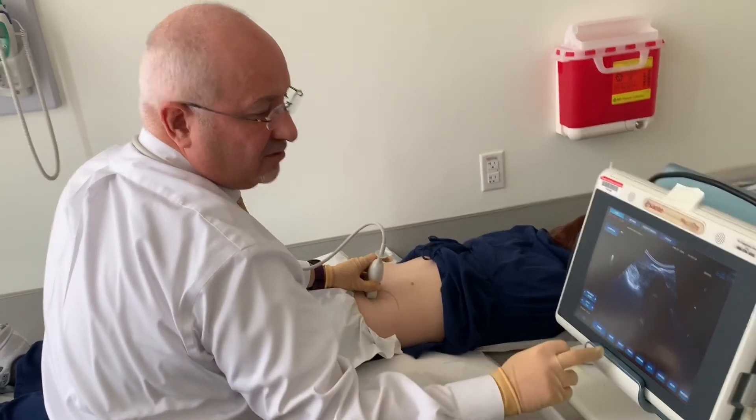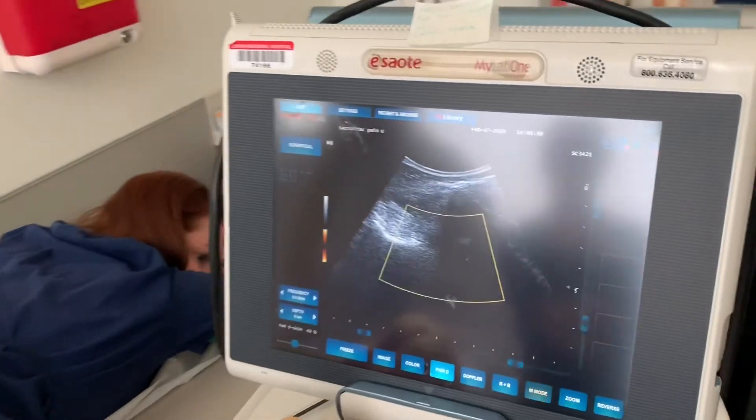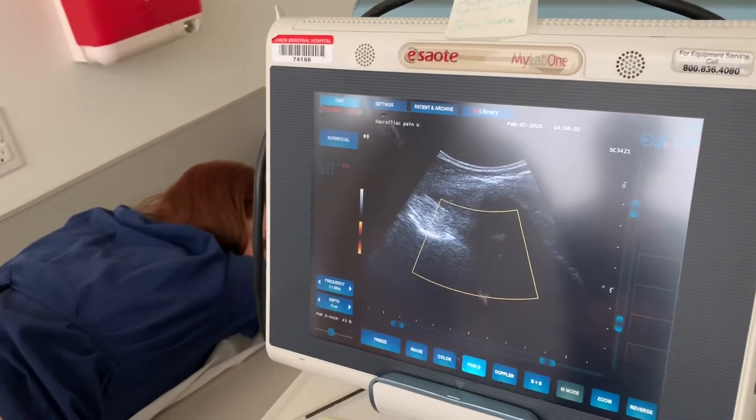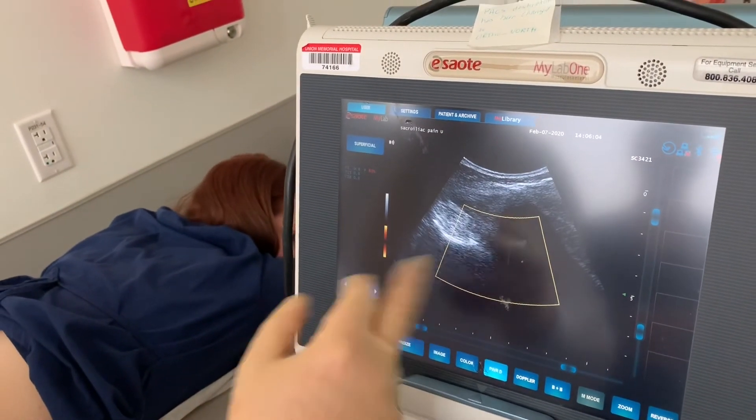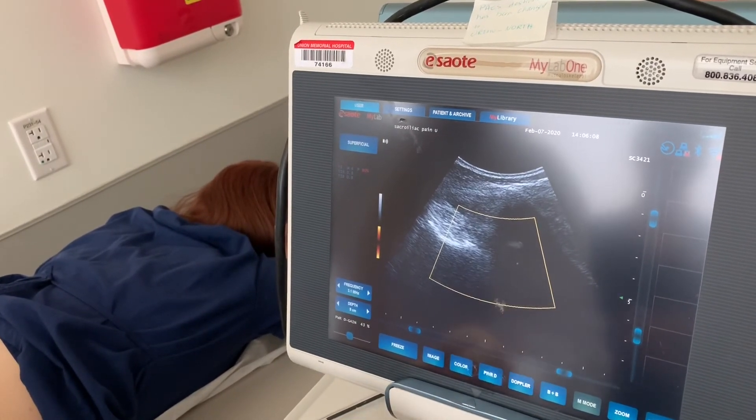You can also use Doppler to check for circulation, just to be sure you're not getting into any vessels. There's no circulation around there — it's all fibrotic — so that's how we confirm safe needle placement.